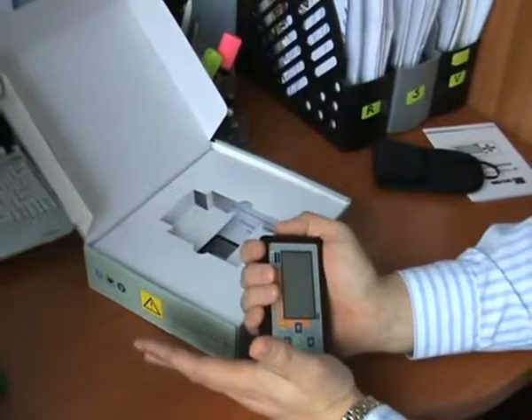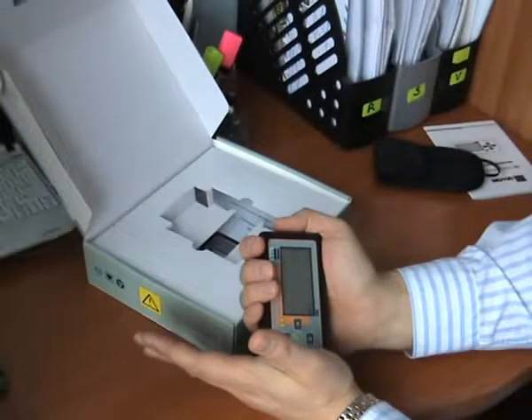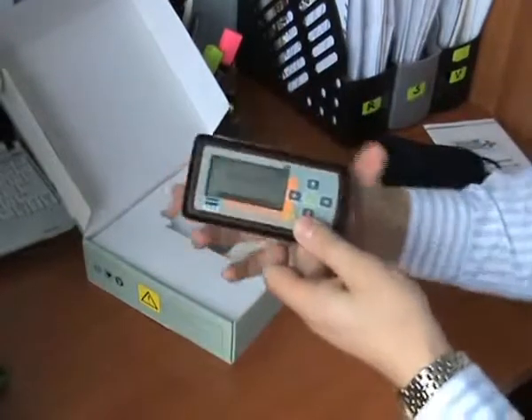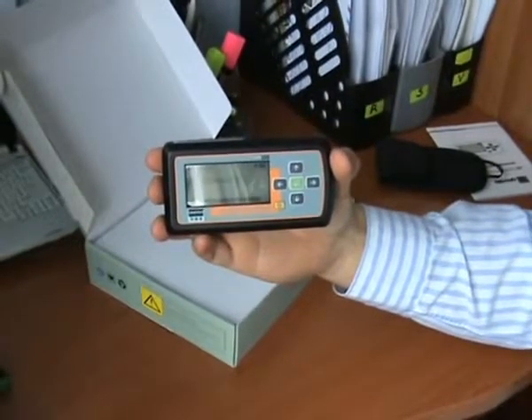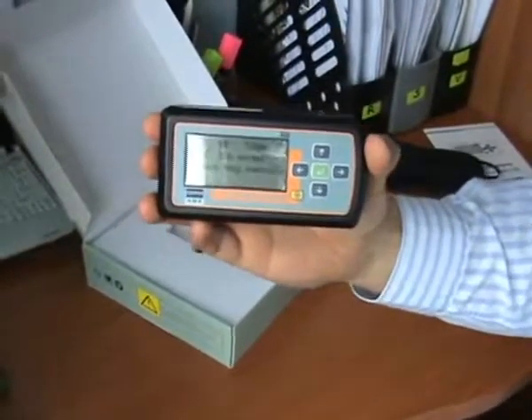Press here to start and you will have 6 seconds to prepare. After one minute everything is recorded and you will wait for the result of the analyzing program.